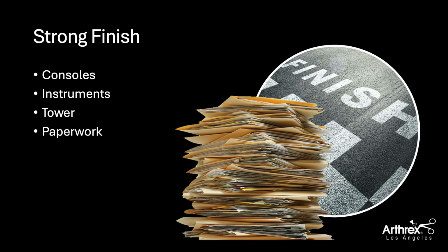Once we get through the consoles, we want to make sure that we go to the instruments. The instruments on the back table, after they've been pulled off the field and they're already done closing up, it's important that we go through every instrument and every tray, identify what's missing, and either write it down or look on the field or look on the floor. It's important that we have all the instruments in these trays when it goes back into SPD.